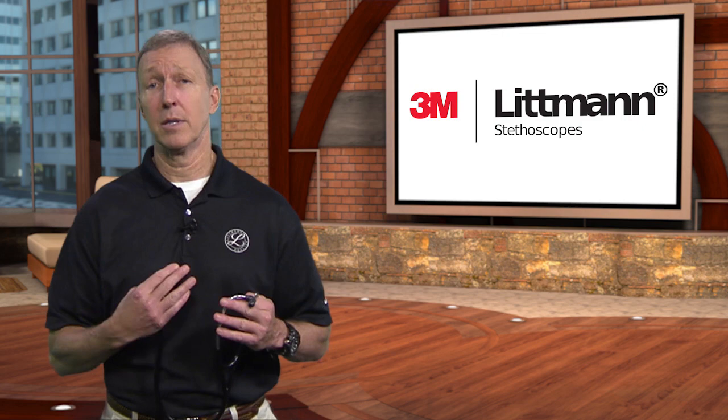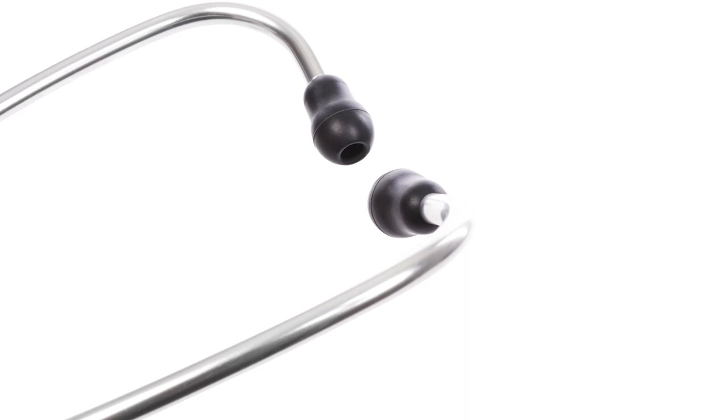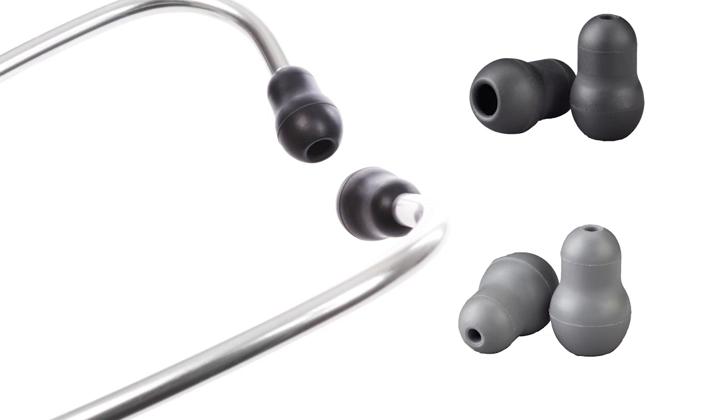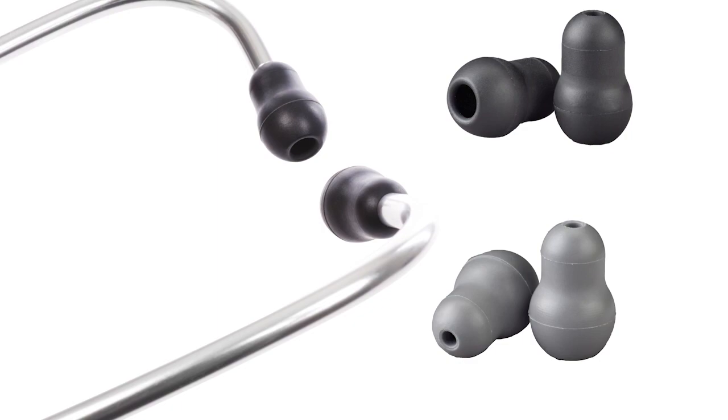The more ambient noise that we can cut out, the louder the heart sounds and lung sounds, making it easier to hear your patient. Run your finger over them and feel for yourself. For optimal acoustic performance, it's also important to use an ear tip size that best fits your ear, especially when using soft-sealing ear tips. All Littmann stethoscope ear tips are available in small and large — try them both to find the size that fits best for you.